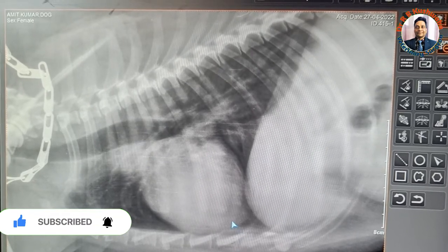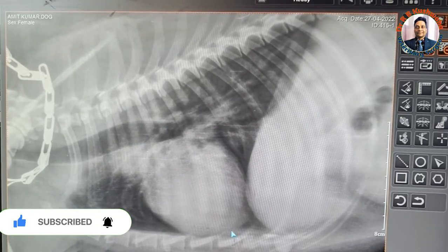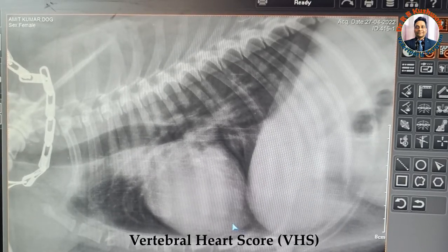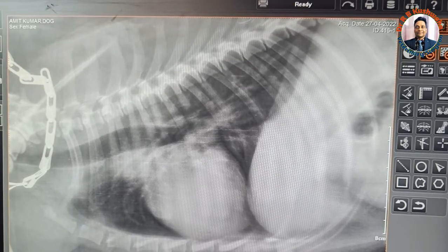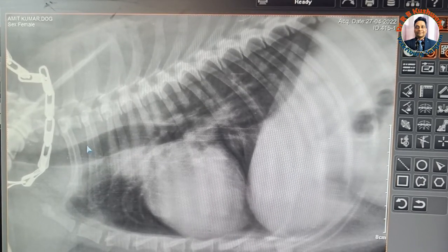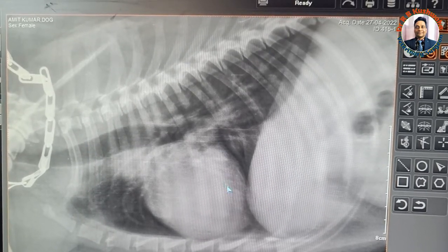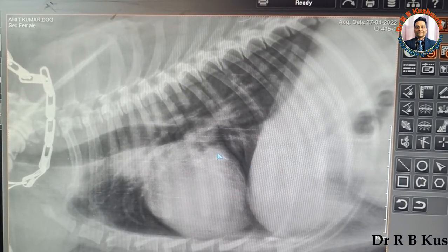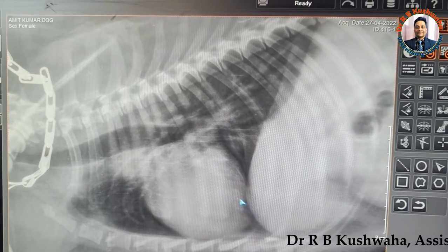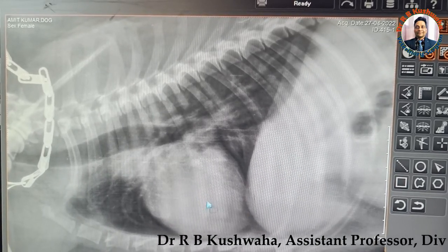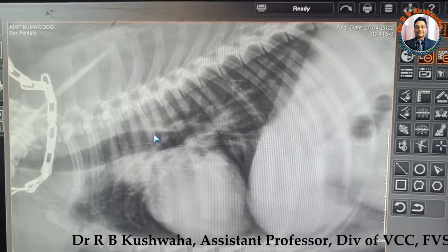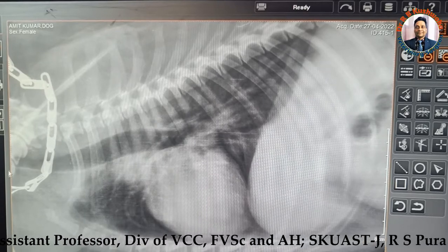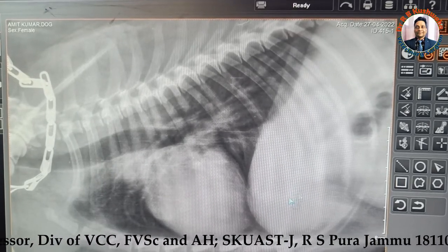Today we are going to discuss the vertebral heart score — how to measure the heart size in relation to the vertebral body. This vertebral heart score is very useful to measure cardiac enlargement or DCM. To measure the vertebral heart score, we must have the right lateral view of the thorax, as you can see in this particular radiograph.